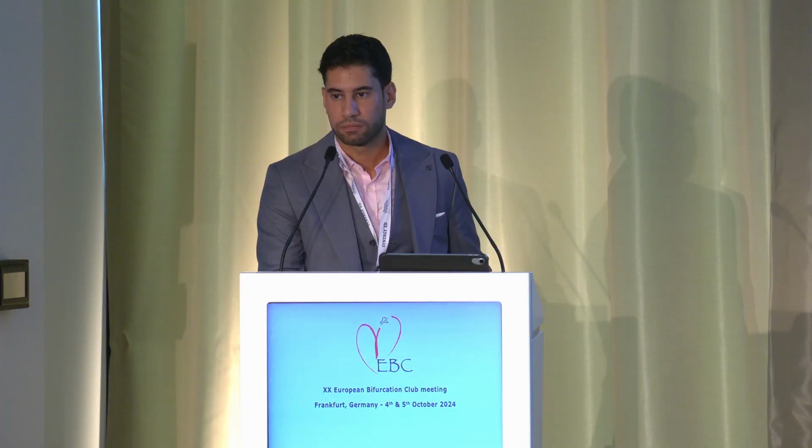You clearly understand that changing tubular stents and adapting them to trifurcation is very difficult, and the interaction between the metal at the end makes the final results very unpredictable, with fancy images at the end. So to me, the number of stents you implant in the trifurcation increases something that we know is unpredictable.